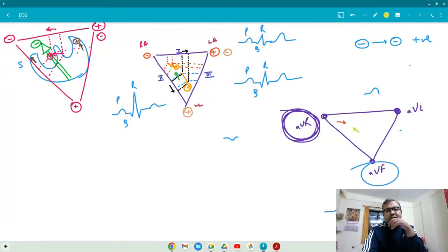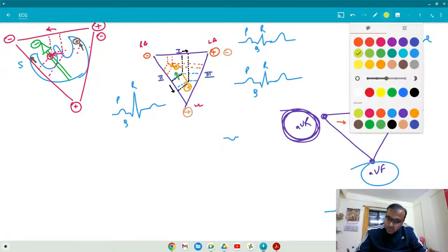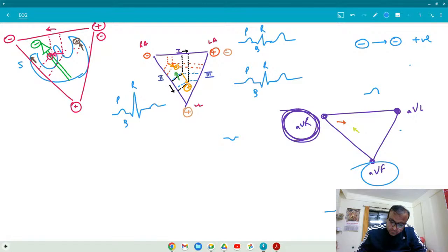All right, so tell me, you know the game, you know the drill. This is septal depolarization. Simply tell me, AVR, the observer is at AVR as I have taught, so it should be positive or negative? Positive. Great. So unanimously everybody agrees it should be positive. Okay, so let it be positive from AVR. Same condition, but tell me about AVL this time.